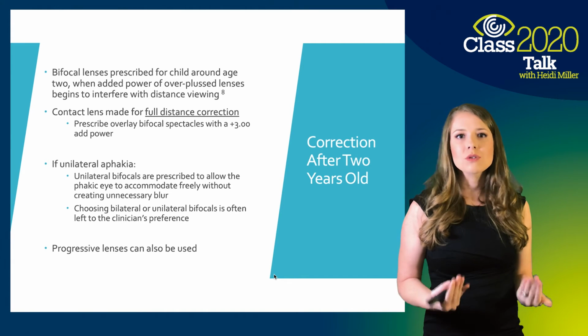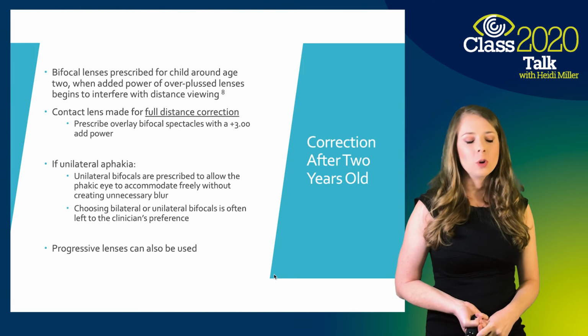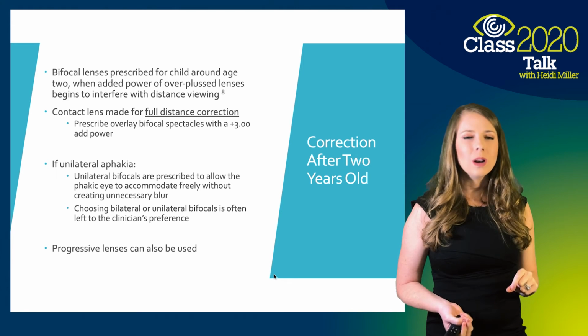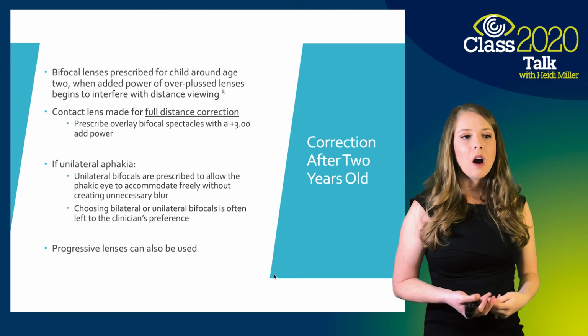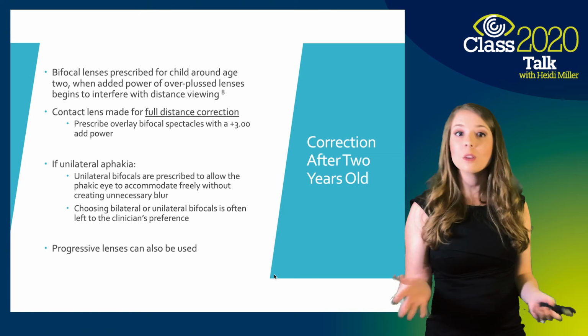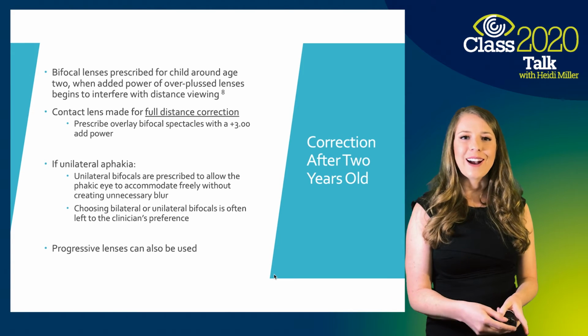But if it was me just picking an option, I usually like to do a bifocal because I want to guarantee that the child is looking through the bifocal. And I can't imagine that with a progressive, they would be getting the full reading add all the time just because it's hard to know where to look. But either one is an option for you. And so you'll do what you feel is best in your office and what you prefer.